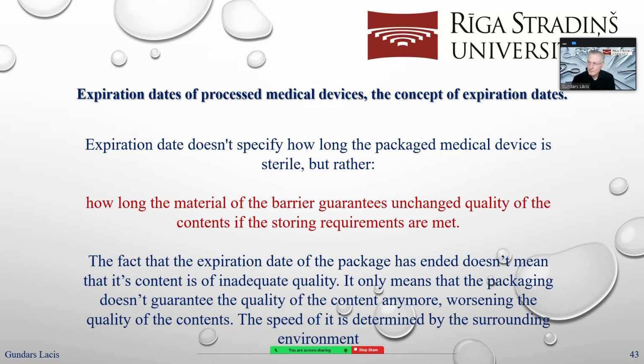Expiration date means not how long the surfaces of the instrument are still sterile, but how long the barrier system can guarantee that the medical device quality is not changing. How long the barrier system or packaging material can guarantee.